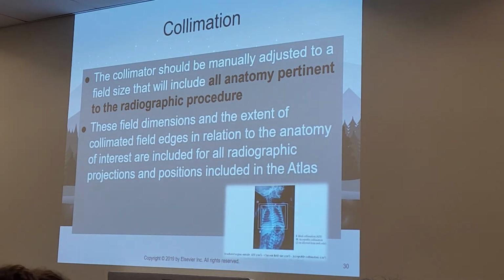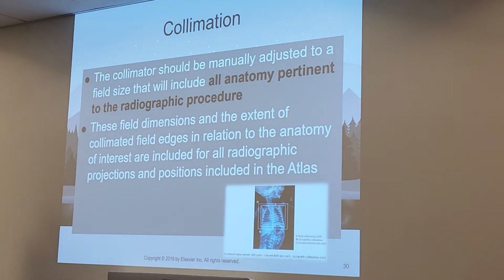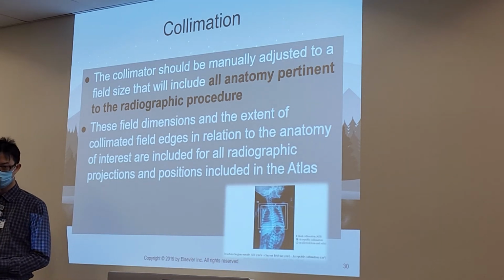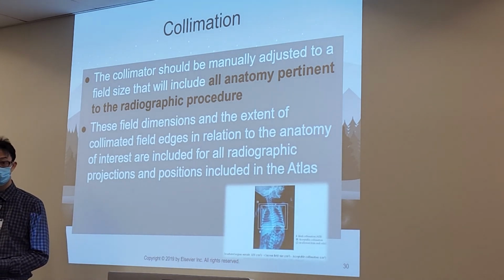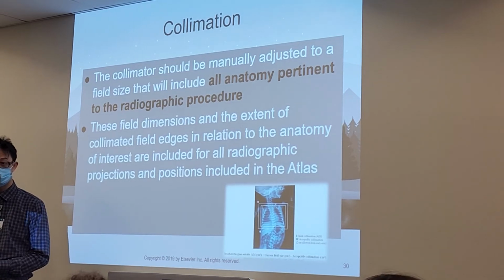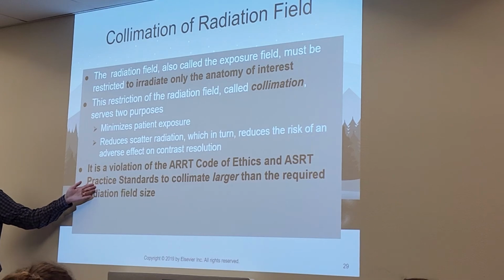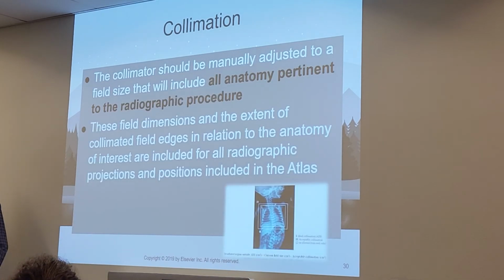Yes? So an example of that would be like collimator inadvertently open to size 14 by 17, or set correctly to 8 by 10. Is that what they're talking about? Sorry, for this here? I'm just looking up an example, I guess.